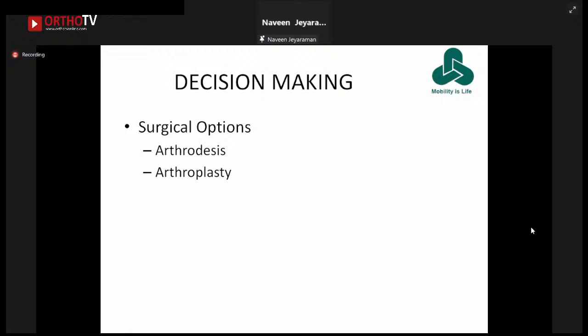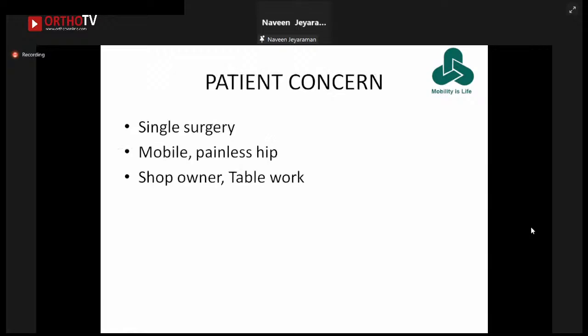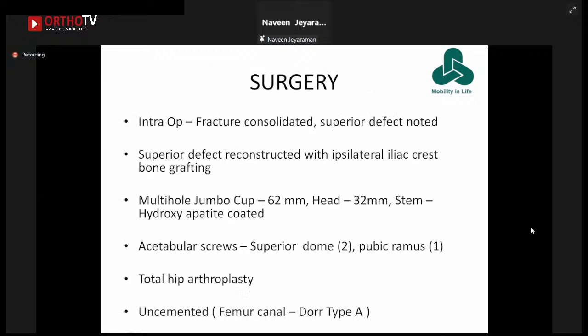Decision making. Currently we have only two options: either we need to fuse the joint or we need to do arthroplasty. Coming to patient demand, the patient is actually a shop owner. So, we want a single surgery, which will give pain relief as well as a mobile joint. So, we proceeded with arthroplasty, which was an uncemented arthroplasty procedure.